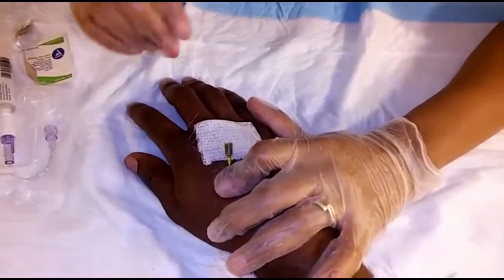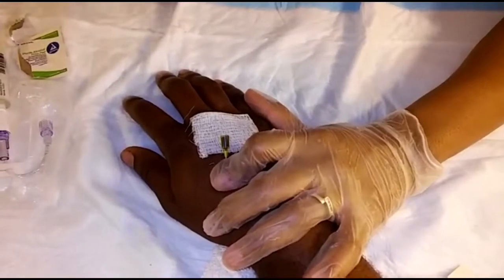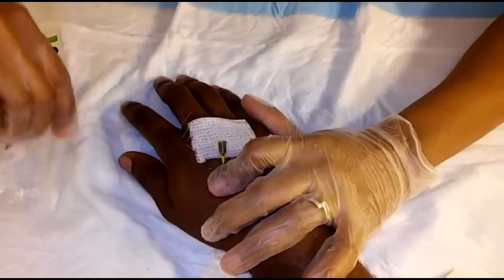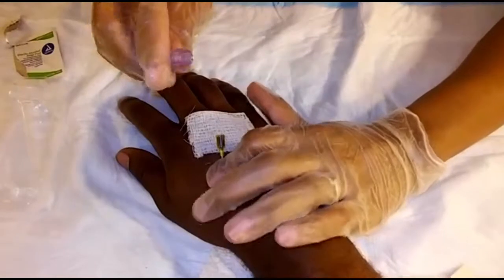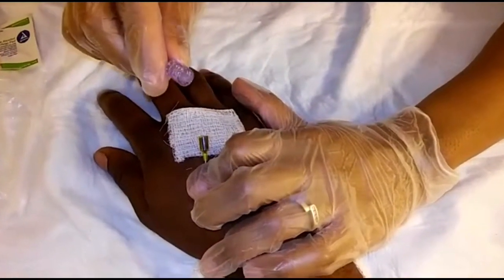Now while applying gentle pressure to keep the catheter stable, I'm going to connect the tubing into the end of the catheter — making sure not to touch the point of entry.